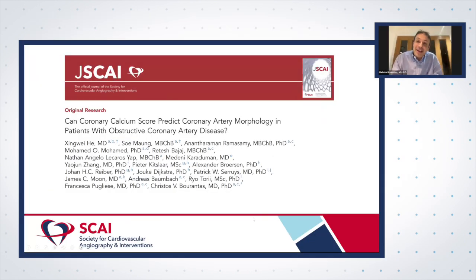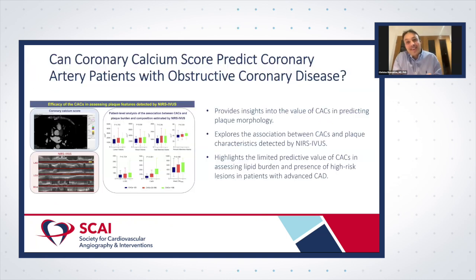Thank you very much for the introduction. I'm an interventional cardiologist. So when I saw the first CT images, I have to admit that I was not impressed. The image quality that you see with intravascular ultrasound, and especially with optical coherence tomography, is something extraordinary. I cannot compete with CT. Nevertheless, we cannot discard the value and the potential of non-invasive imaging in risk stratification and treatment planning. So in this study, what we're trying to do is to challenge computed tomography and explore the value of computed tomography in assessing plaque pathology detected by intravascular imaging. So what we have done, we have performed a prospective study, including patients with stable coronary disease that came to the cath lab to have percutaneous coronary intervention.